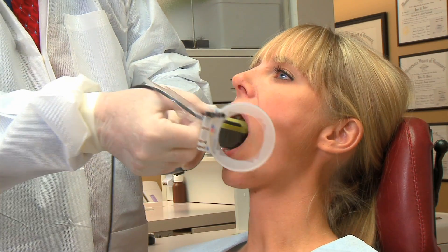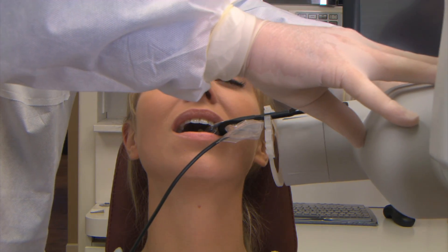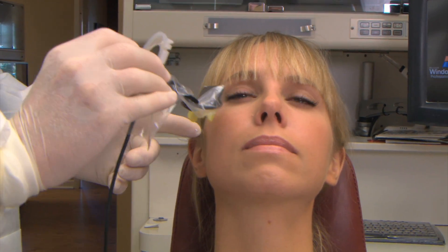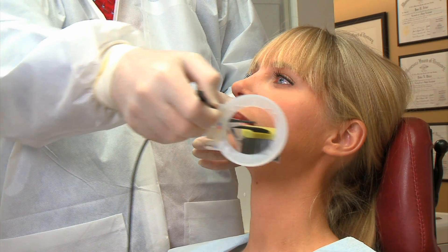For the opposite lower left, position the cone and take your x-ray. With this setup, you get the upper right — one, two — and the lower left — three, four.